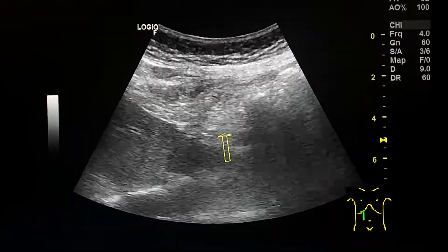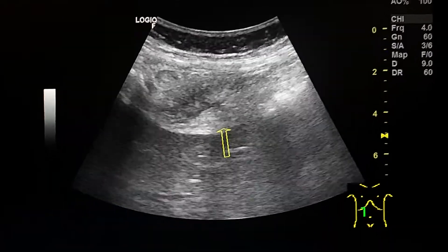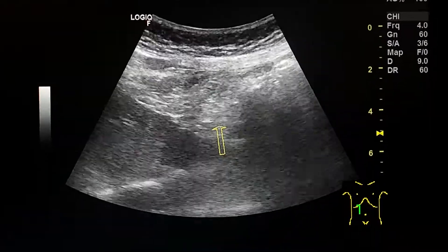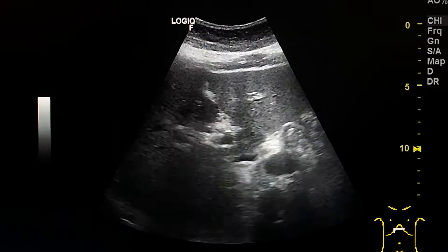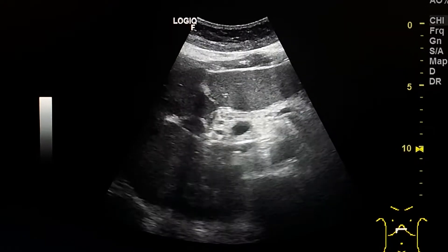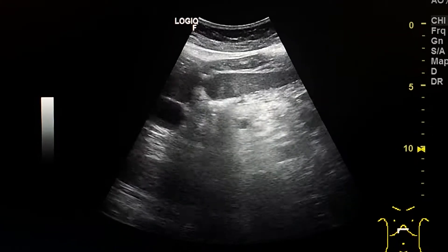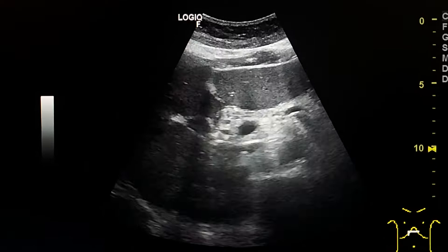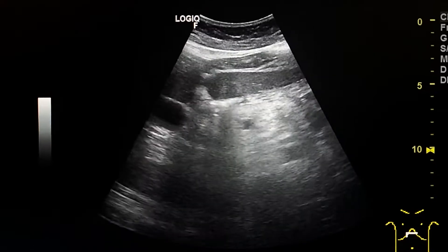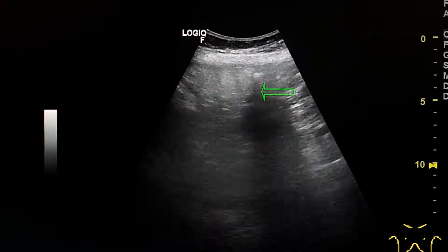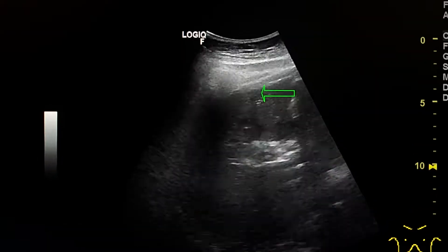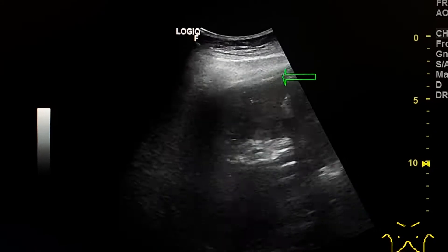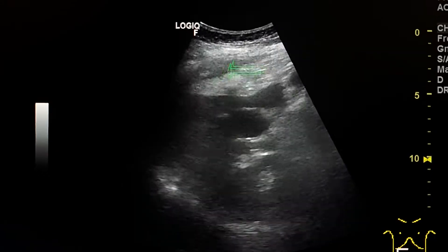The sagittal section. This is the liver, gallbladder and pancreas. This is the omental infarction.